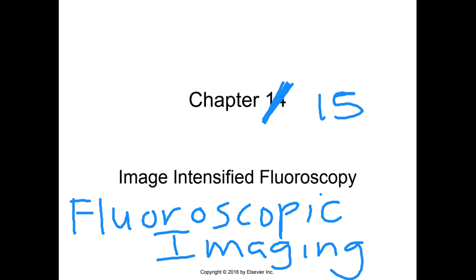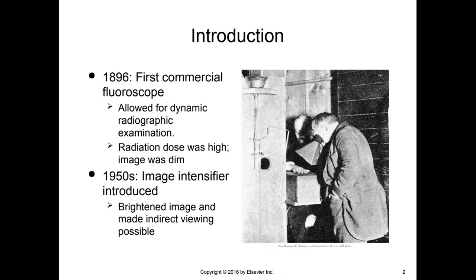Hi everyone. Today we're going to go over chapter 15 in your book. It is called Fluoroscopic Imaging on page 216. This should be somewhat of a review from Physics 1.